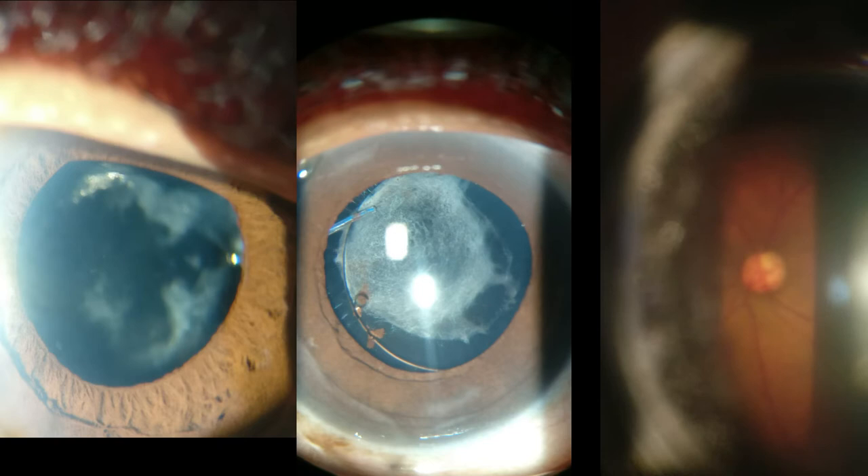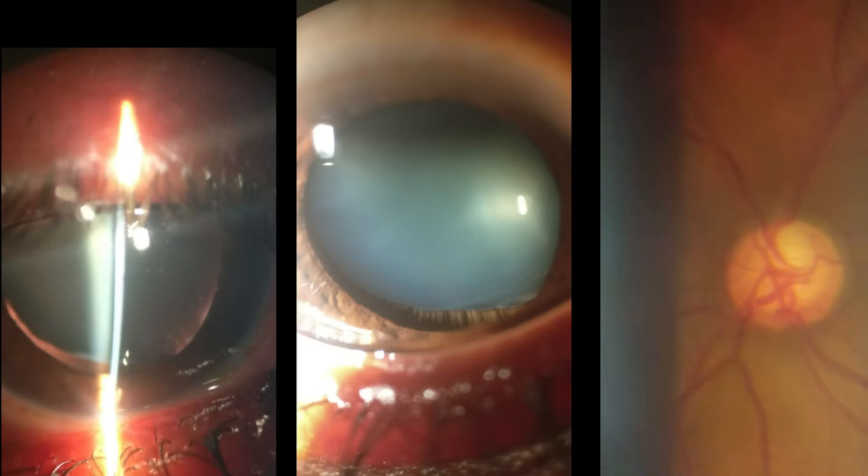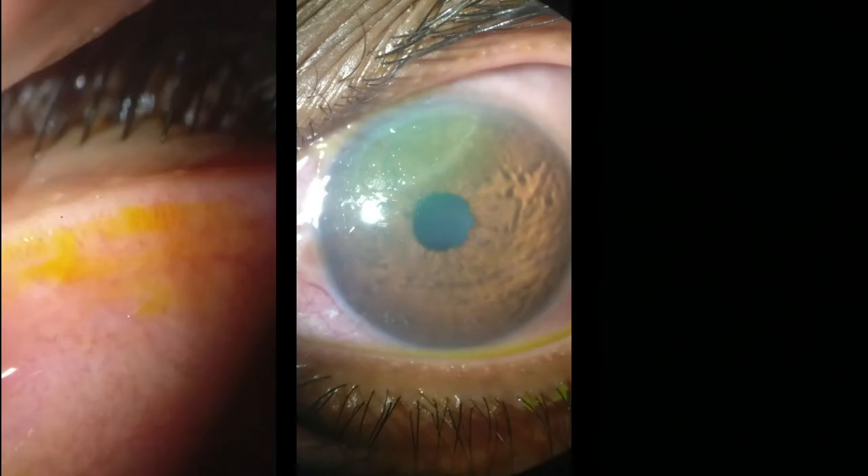You can see posterior capsule opacification and the YAG capsulotomy performed for that. On the right, the YAG capsulotomy with pitting of the IOL. Here you see the zonules on the left, and on the left you see the subluxated lens.